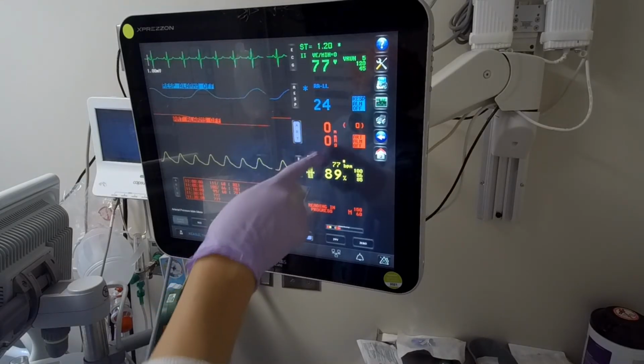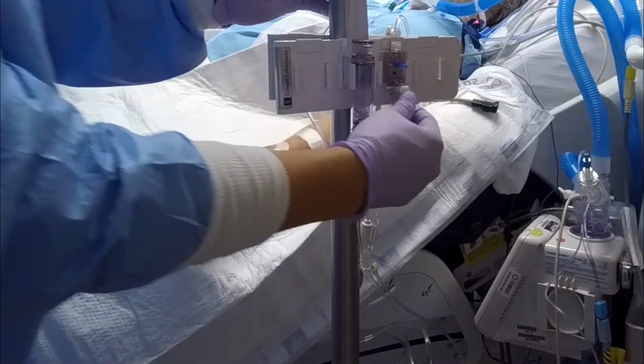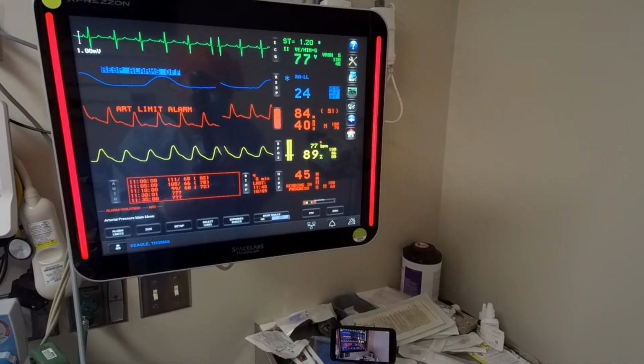You need to see 0 right here, okay? Then, let's go back to the transducer. You're gonna close it on there. Now it's zeroed.